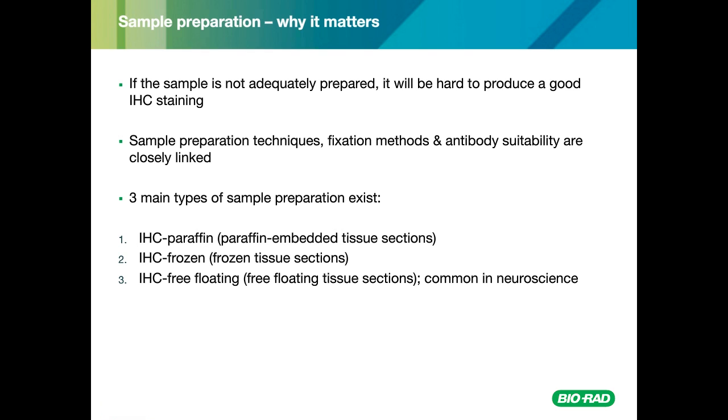Can't I always follow the same protocol? The sample preparation matters, as your IHC staining result will only ever be as good as your sample. Therefore, care has to be taken in order to identify the best method for staining your proteins of interest. Sample preparation techniques, fixation methods, and antibody suitability are also closely linked.